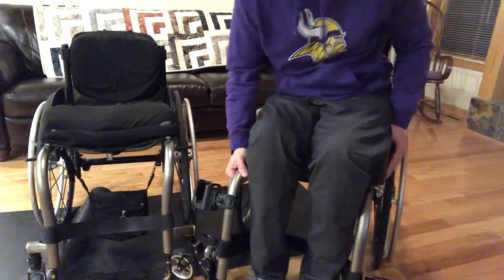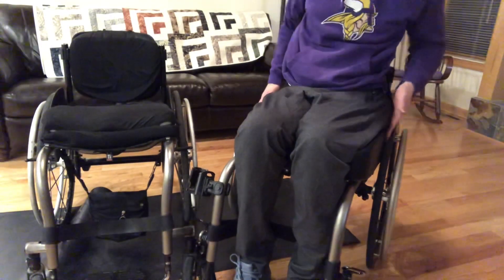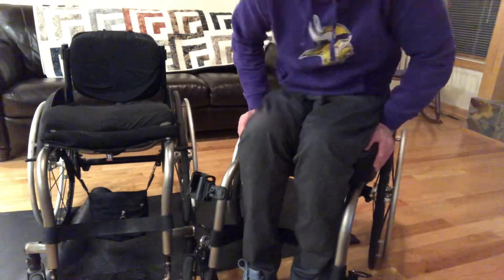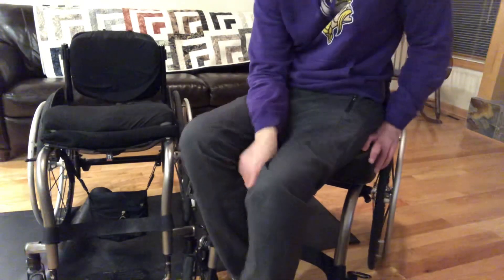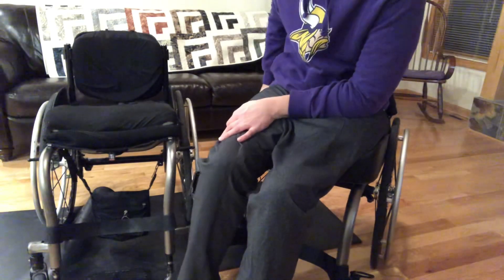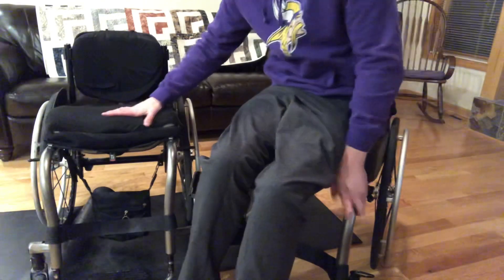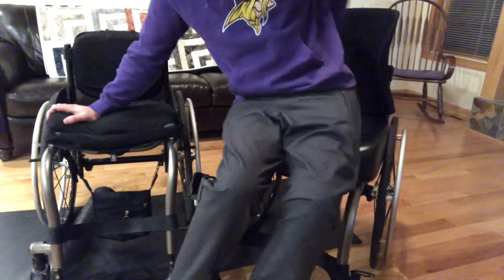I actually got this cushion on wrong — my cushion is leaning up against this tire. So I actually have to transfer. You can see I don't have side guards with my chair here, so I have to be a lot more careful when it comes to putting my cushion back on. It's got to be on perfect.